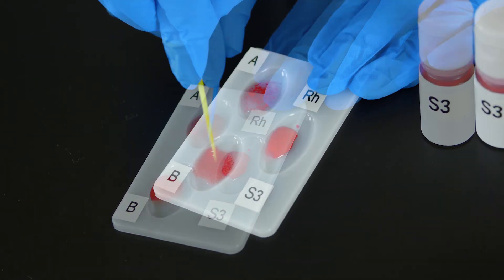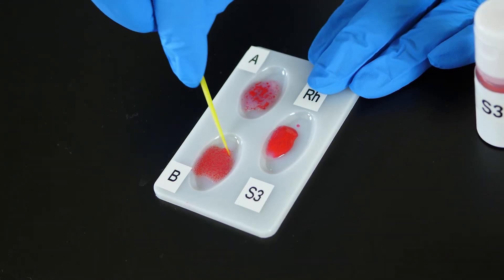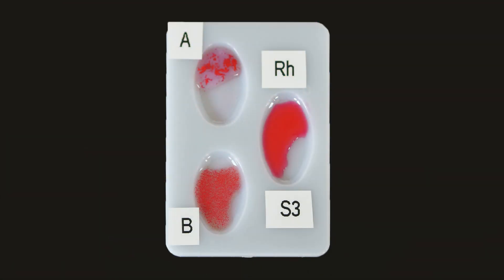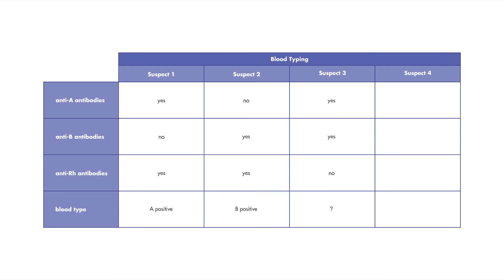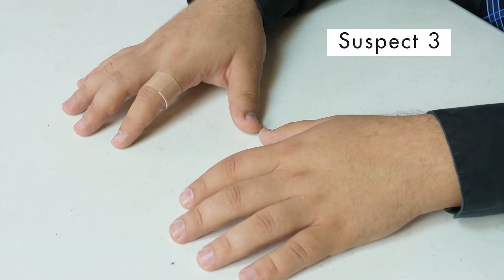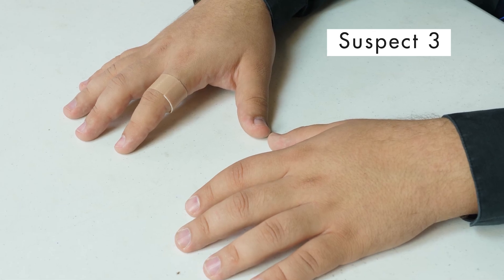Now we test the blood of suspect 3. The cells in well A and well B are sticking together, but the cells in the Rh well are not reacting. We conclude that this blood type is AB negative. The blood of suspect 3 matches the blood found at the crime scene, so it is probable that suspect 3 took the sandwich.